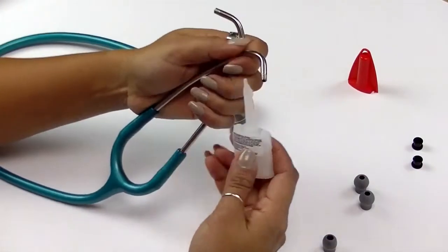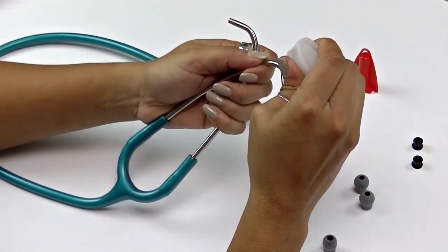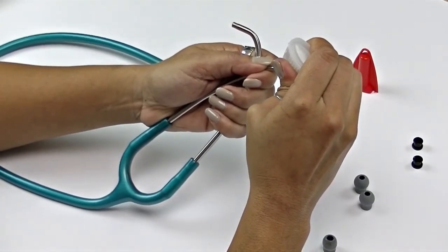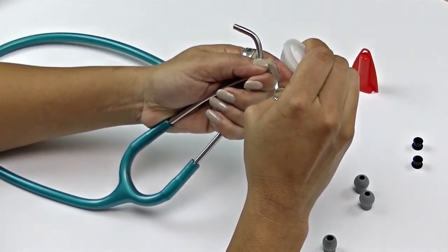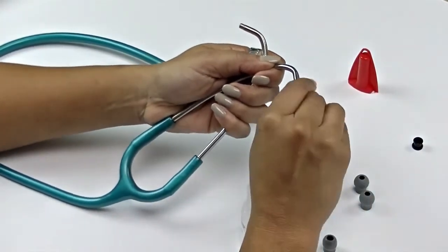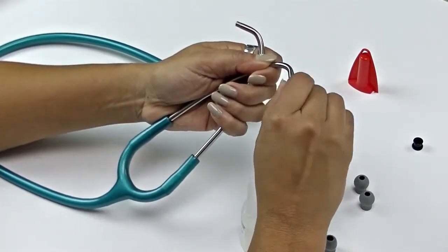Apply a small amount of crazy glue to the threading on the binaural to help create a permanent fix. Hand thread the adapter over the glue and tighten. Don't over-tighten, as you may strip the plastic threading.